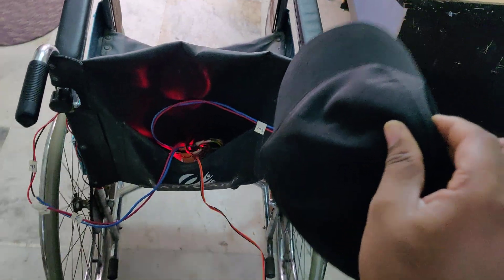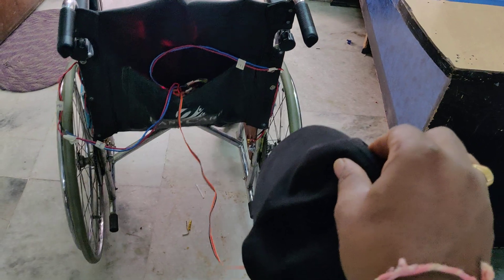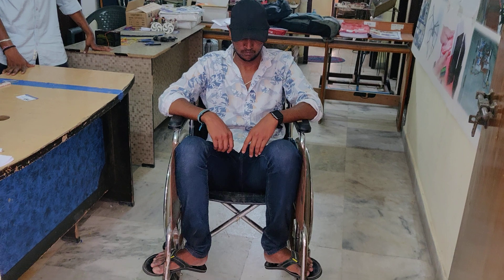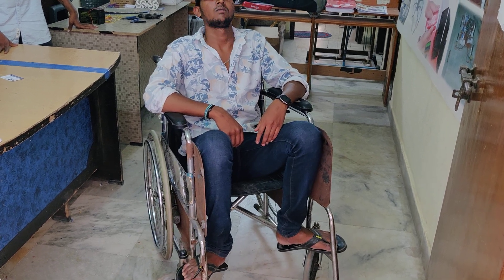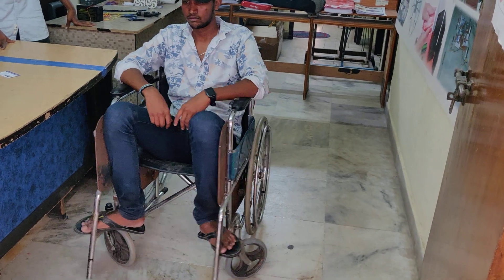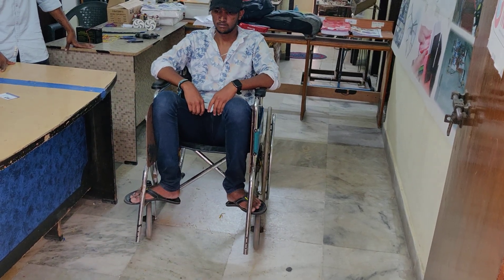The wheelchair responds to backward, forward, left, and right head tilts. Let us see the demonstration in real-time: forward, back, right, left, right — the wheelchair moves in each direction corresponding to the head motion of the user.